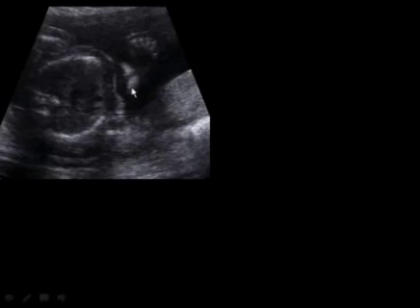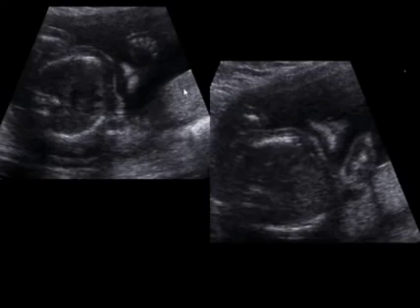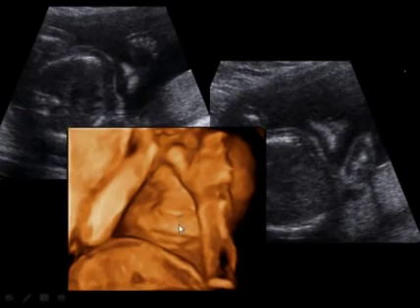Here's another patient who was brought to my attention because of the possibility of a cleft lip, and here's the upper lip right here. The rest of the face would be here, and there is a vague cleft right in the midline, sort of obliquely there. But if we scan a little bit more posteriorly, we can see that actually the lip is completely intact when I have the nose on the image, and this is just a prominent philtrum or that cleft in the soft tissue in the upper lip. And it can be confirmed, if possible, with 3D imaging. Here's an image of the fetal face, and we can see that the upper lip is completely intact.